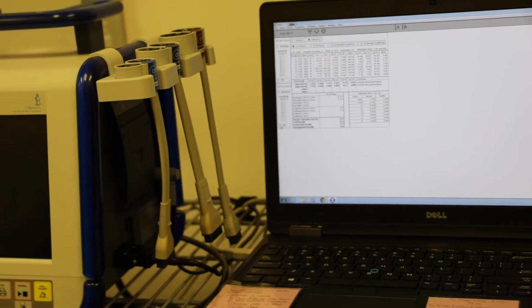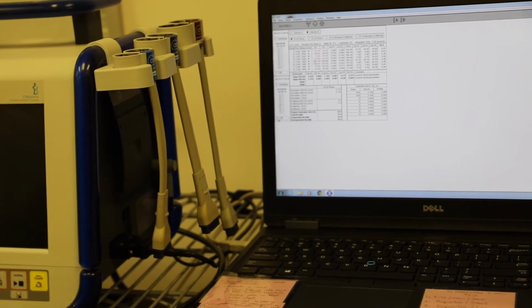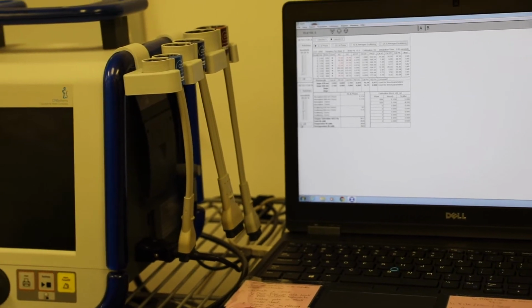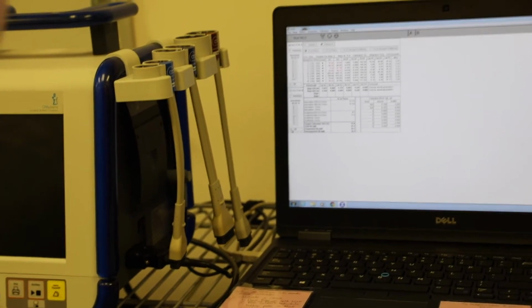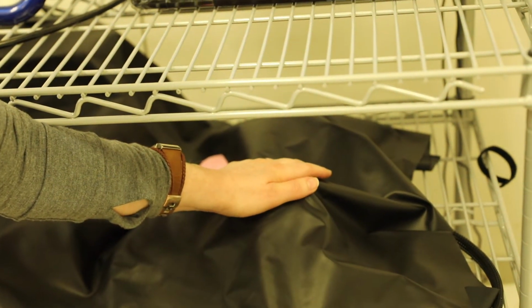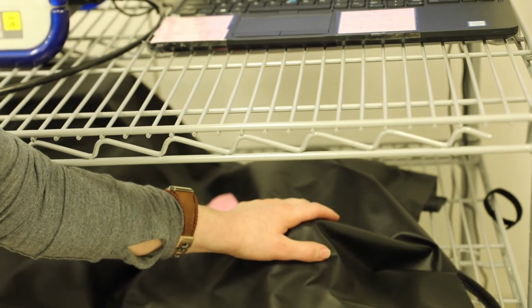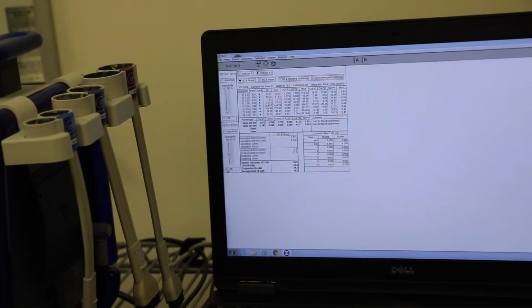One thing that can also make your values come off a little bit low or a little bit high is pressing too hard or not hard enough on the block. So just make sure that you're using the same amount of force with your hand pressing on the block for the calibration and for the check. And once those values are all good, then the NIRS is completely calibrated and ready to use.